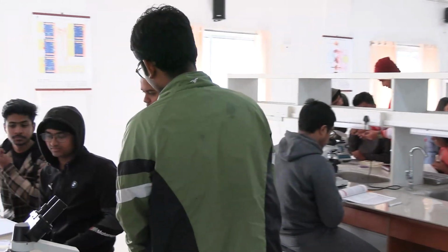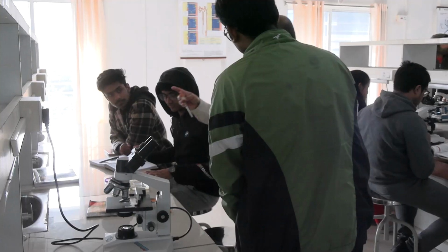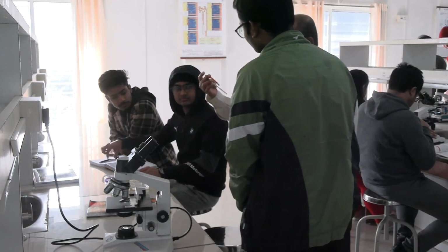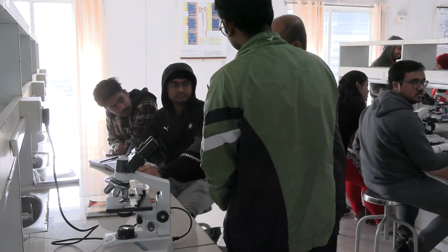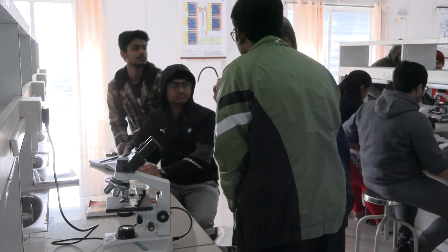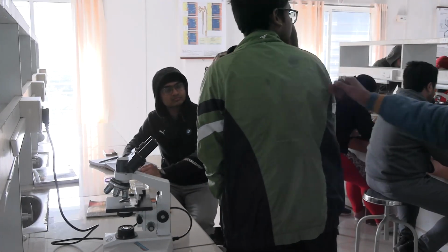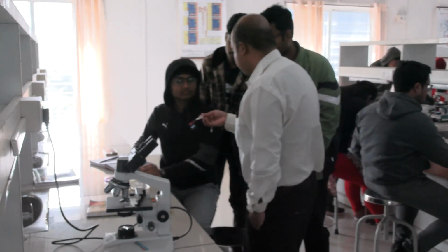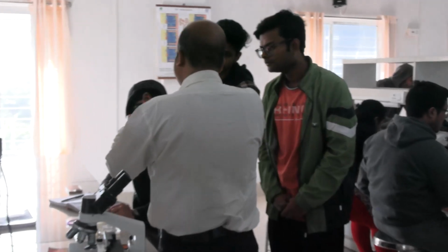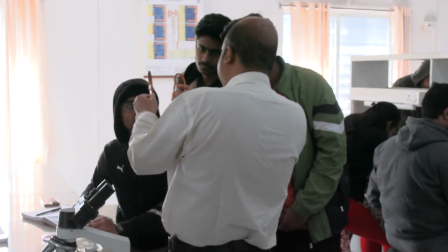Okay, this is the diluting fluid. This is the RBC pipette and the WBC pipette. Pipettes are what we use to suck blood or fluids. These will be identified according to the size of the bulb. Here the color of the bead has faded away, so don't look for the red bead. In the RBC pipette the bead inside the bulb is usually red, but it fades away with time. So you have to identify by the size of the bulb, and the marking is 101. Markings may also fade away, but the marking is 101.